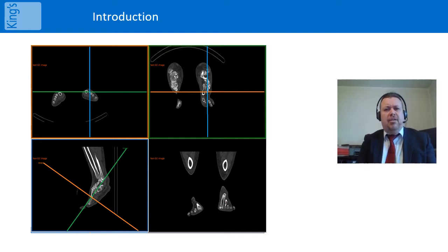What's happened here? The patient wasn't laying prone. Are the left and the right images swapped? I don't think so. If that's not happening, what is? Has the slice order changed? I'm not sure. Now, if I don't know what is happening, then it isn't fair to present these images to someone else for reporting. How are they going to find out what the correct views are?